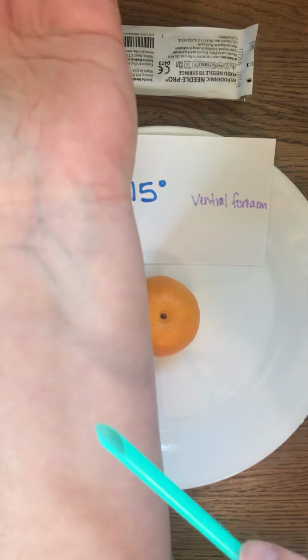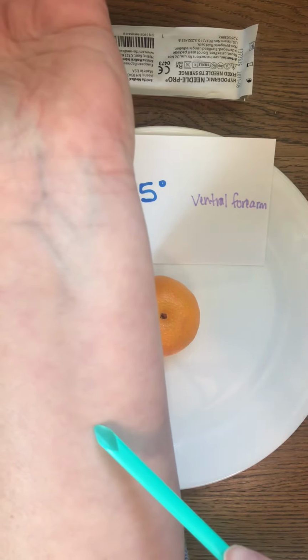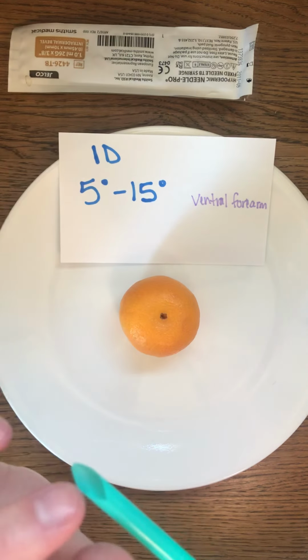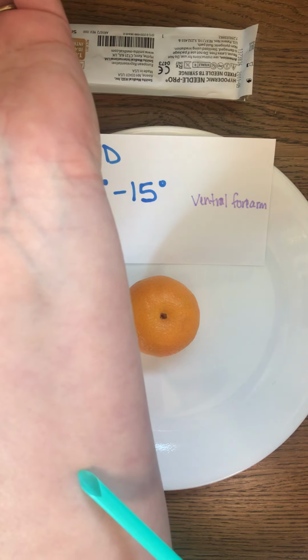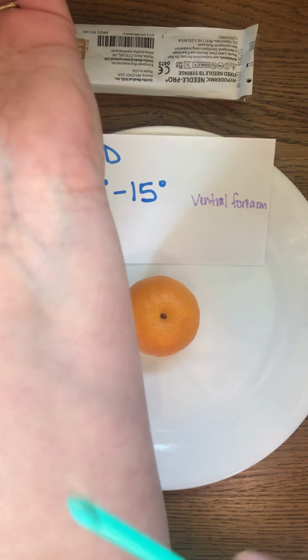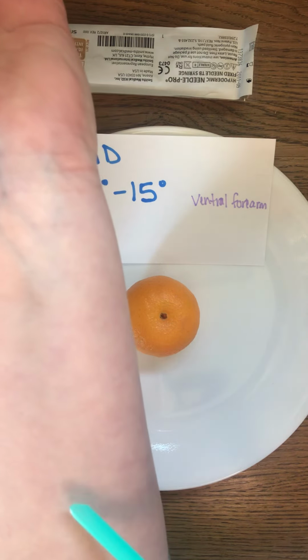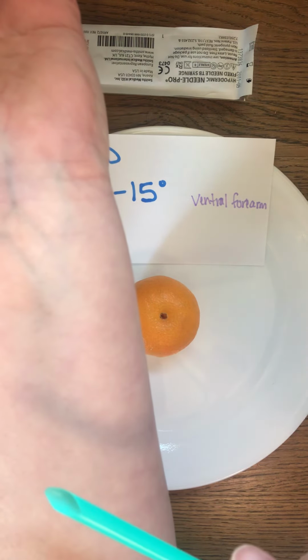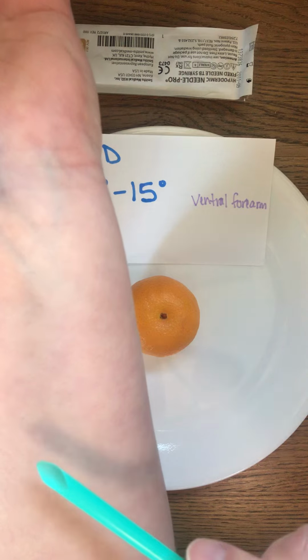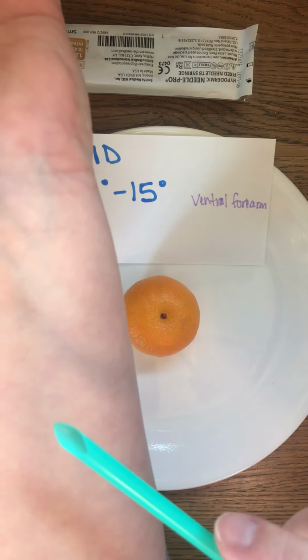If I were injecting myself, I would go in like this, and the sharp end is going to be the first that gets in and punctures the skin. If I flipped it over, you can see that it could actually just scrape across the skin as opposed to going into the skin. So you want to have the bevel up.